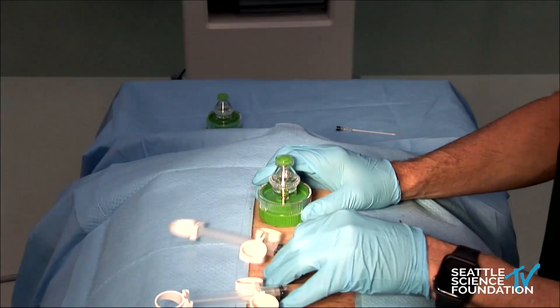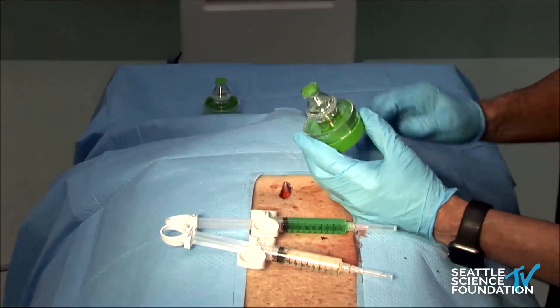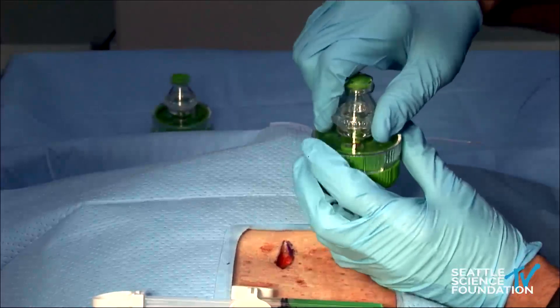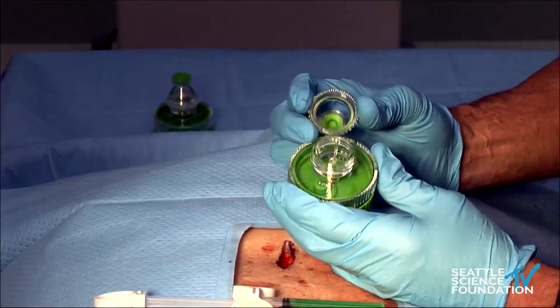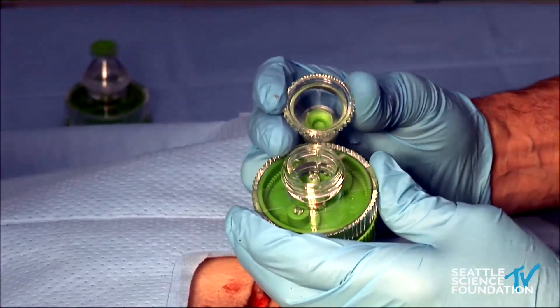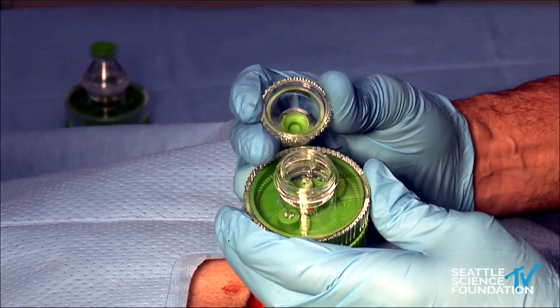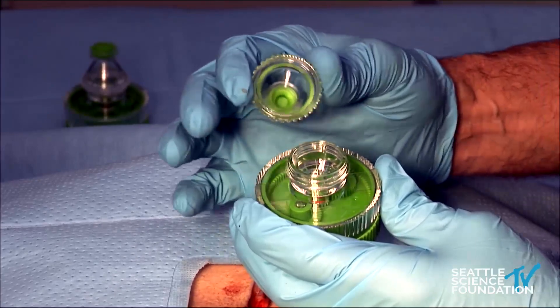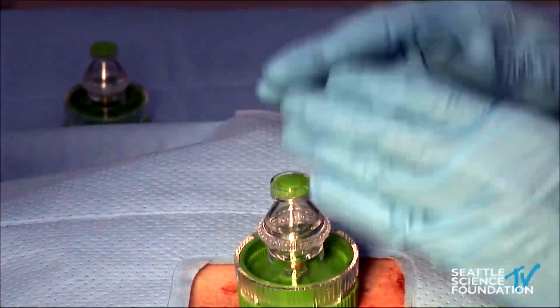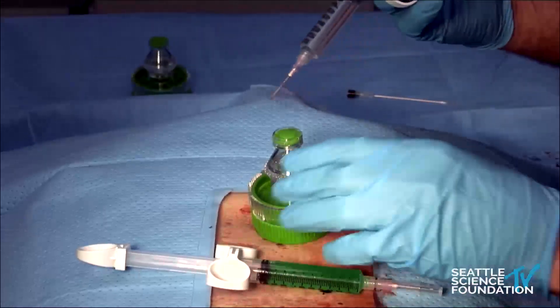I'll demonstrate the mixing first. This is the container that the micronized disc comes in — this one doesn't have any material in it for demonstration purposes. The disc material is generated from donated cadavers, with the disc and end plates removed, ground to 300-micron aliquots. There is 0.75 cc's in the container, which comes shipped in a sterile container.